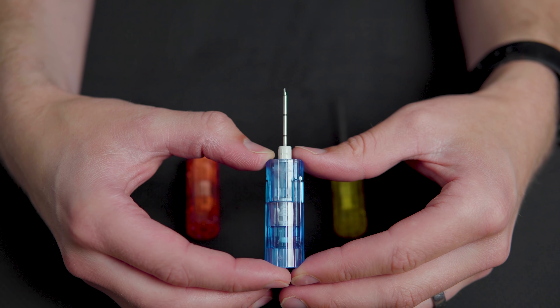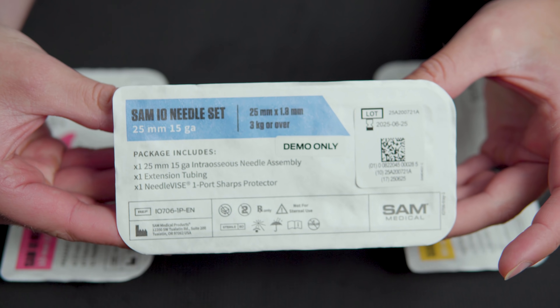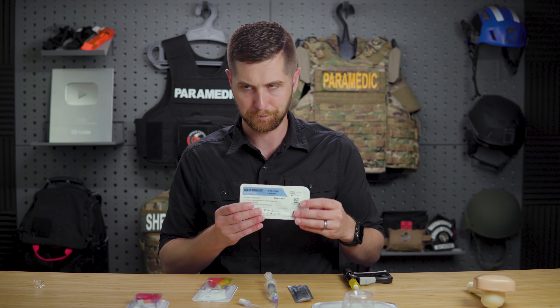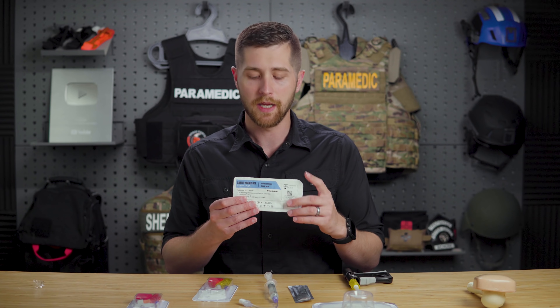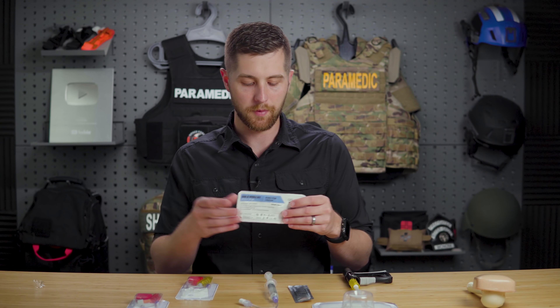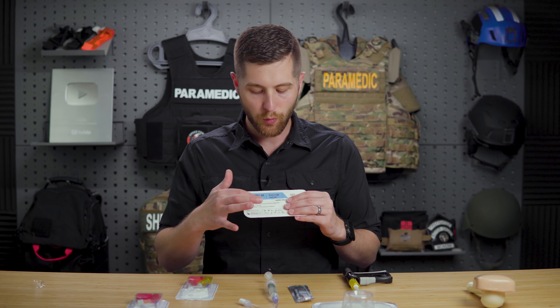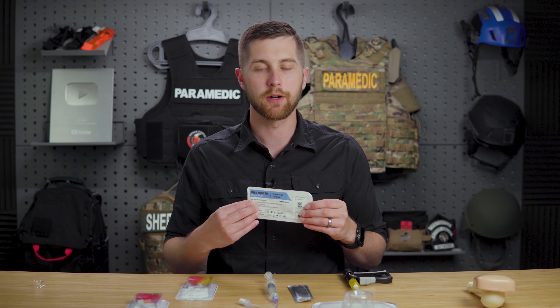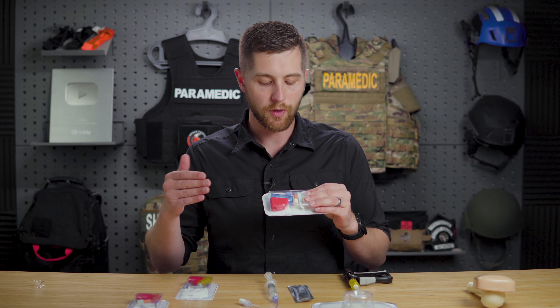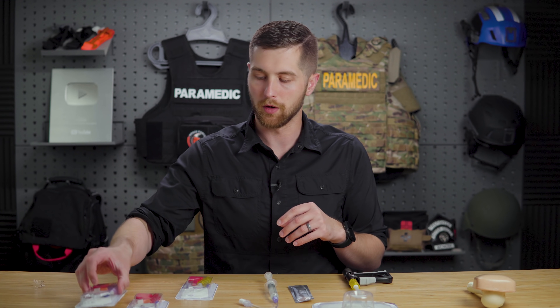Next, the blue needle is a 25 mm, 15 gauge needle for patients over 3 kilograms generally. The cool thing is you can start a large yellow needle on your smallest patient — you just don't insert it all the way. The weight sizes are a general guideline, but it really depends on the patient. I generally find the blue needle best for the proximal tibia, since there's not a ton of adipose tissue there, and it works great for adults.